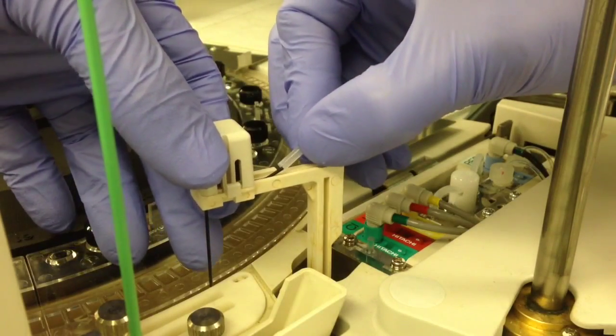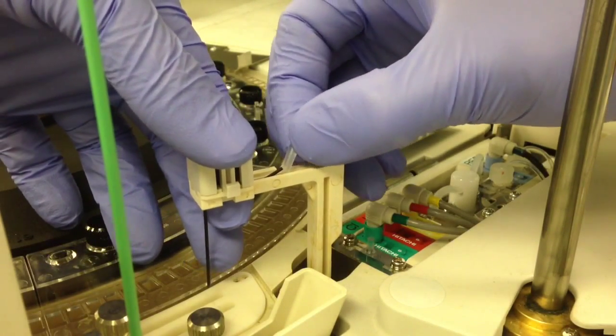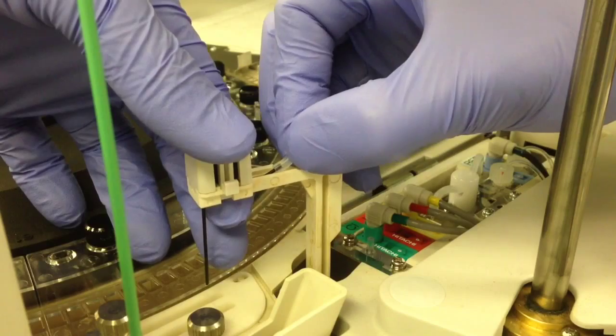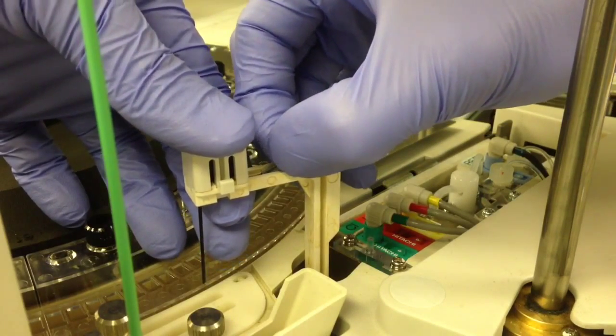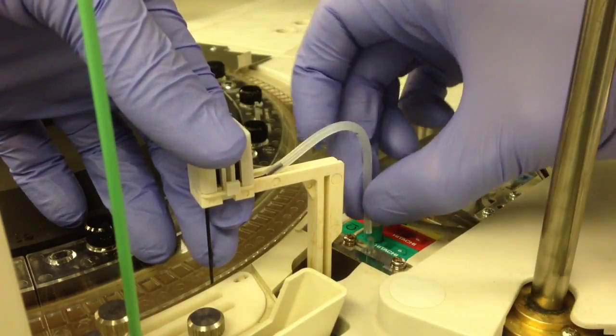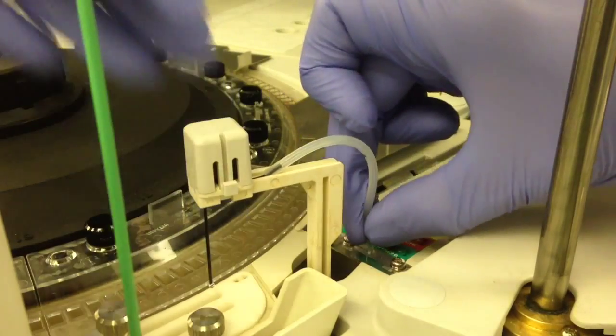Then go ahead and finagle it back on, which can be a little bit awkward. But like I said, just be careful when you're attaching things back onto the sipper probe. You don't want to bend anything.